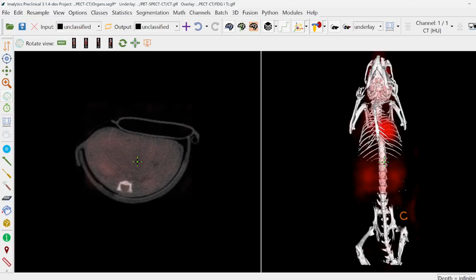We recommend performing some pre-processing on your image datasets, to crop out one mouse and really focus the analysis on one mouse. Otherwise your datasets will be too large and the analysis and segmentation operations will take too long.